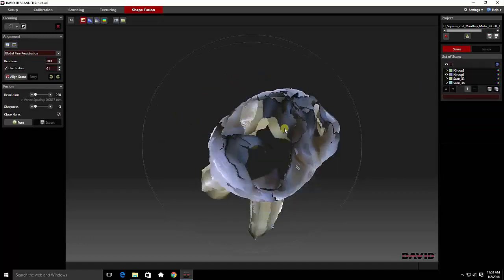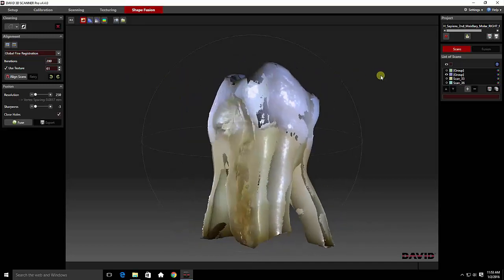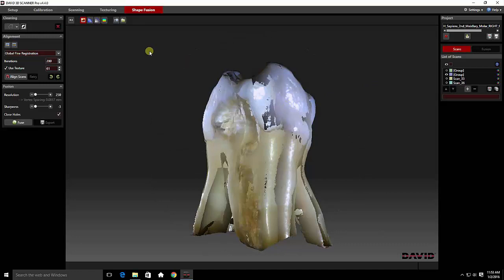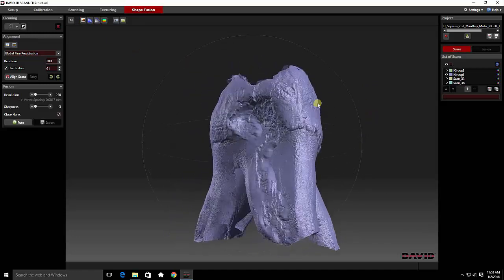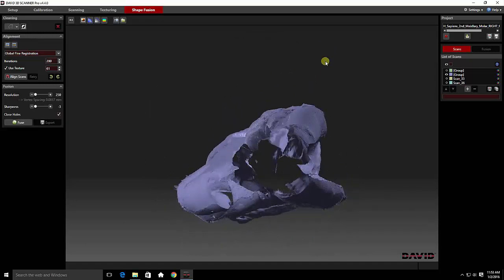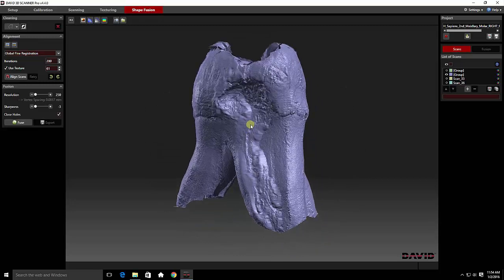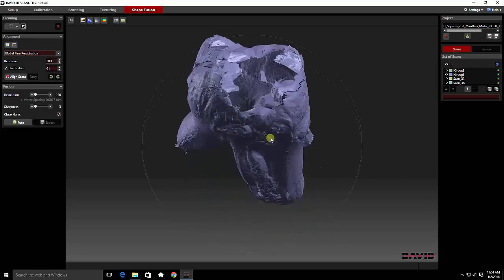Allow me to show you the completed cleaning of the initial rotation of the tooth. As you can see, everything is nice and sharp, smooth, and well defined. We have a few little flares here, but there's a smoothing portion during the fusion that eliminates a lot of these errors. So one need not waste all of their time going for an exact polish on all of these images.